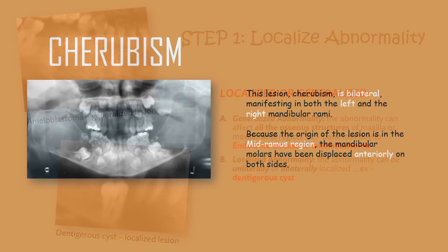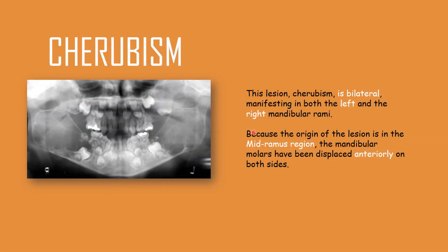For a bilateral lesion, cherubism is a good example. This lesion, cherubism, is bilateral, manifesting in both the left and right mandibular rami. Because the origin of the lesion is in the mandibular ramus region, the mandibular molars have been displaced anteriorly on both sides.